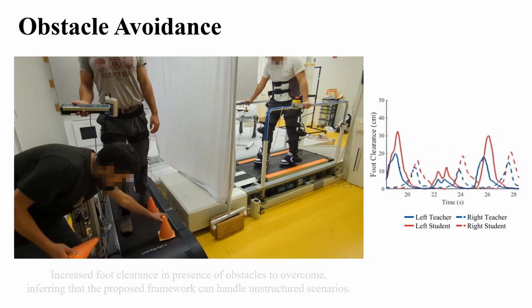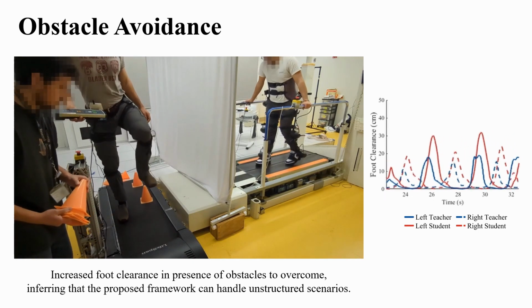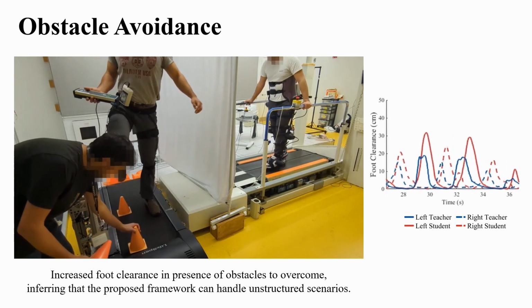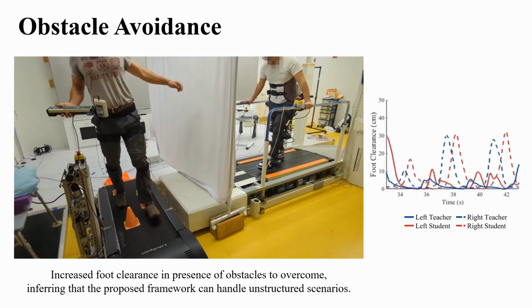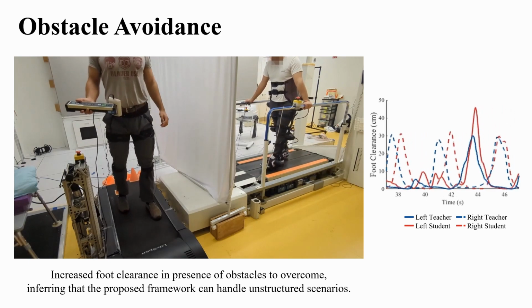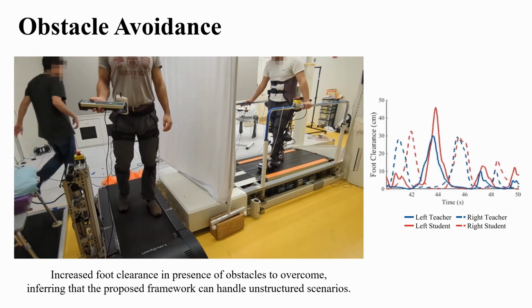encountered. As seen in the video, the increased foot clearance was matched by the student, while relying only on the haptic feedback. This scenario can be useful in unstructured rehabilitation exercises that are difficult to facilitate with exoskeletons using predefined trajectories. Introducing obstacles to the therapist's path can transmit forces to the patients that we refer to as virtual obstacles. Such an approach can promote movement variability without interacting with physical obstacles that could pose a risk to the patient.